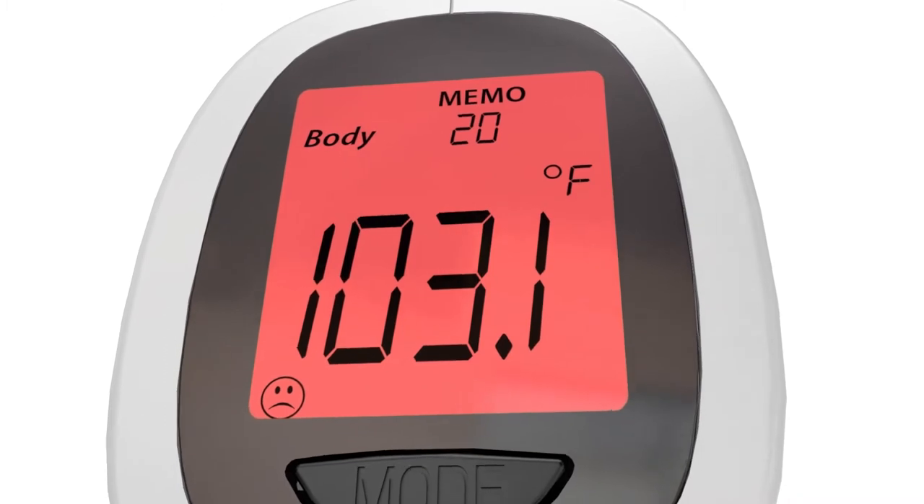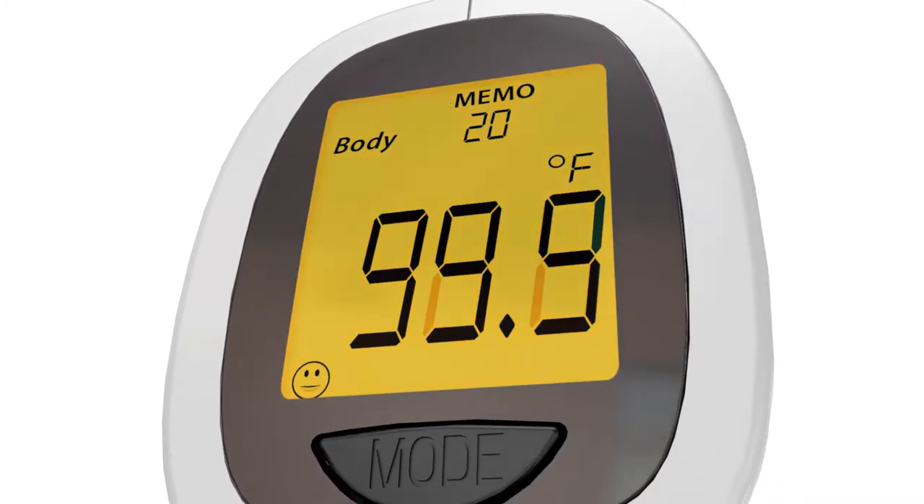When checking a body temperature, the colors on the display will help to identify a fever or a normal temperature.